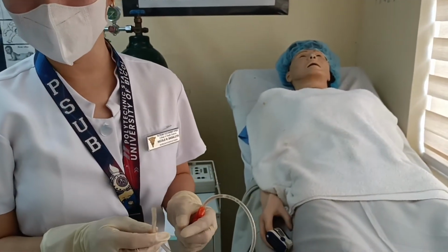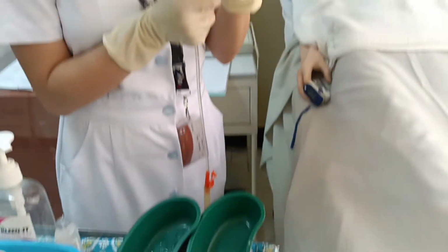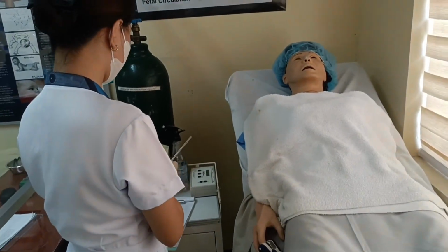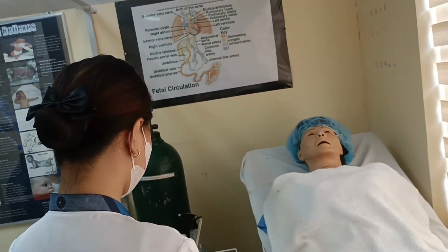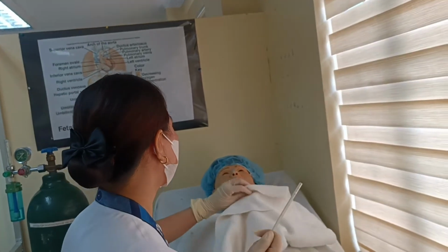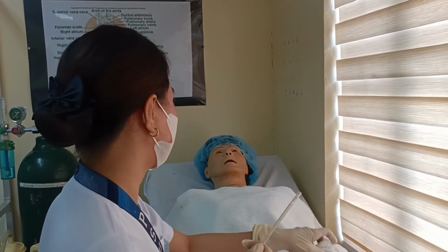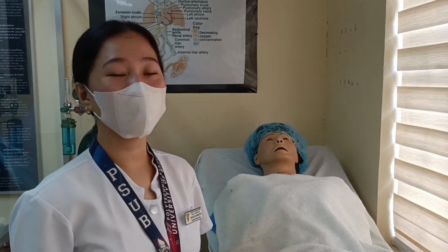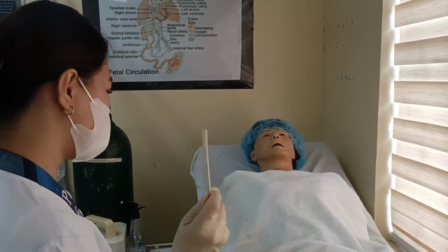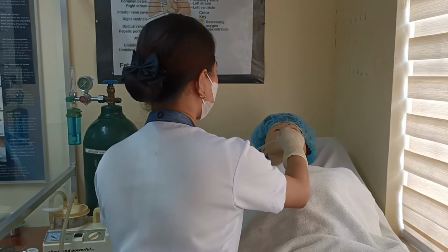Then next we are going to wipe the catheter to remove the secretions and then discard. Then ma'am, let me help you to wipe your nose. Then next we are going to suction the oropharyngeal. So let's assume that this is sterile. So we are going to measure from mouth to earlobe, at least 10 to 15 centimeters.